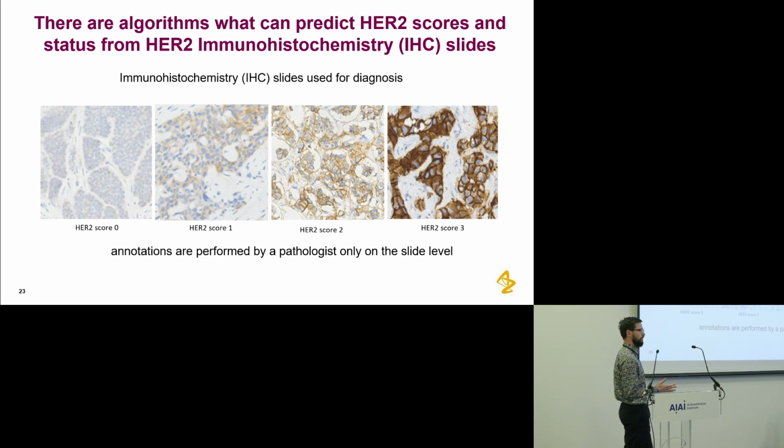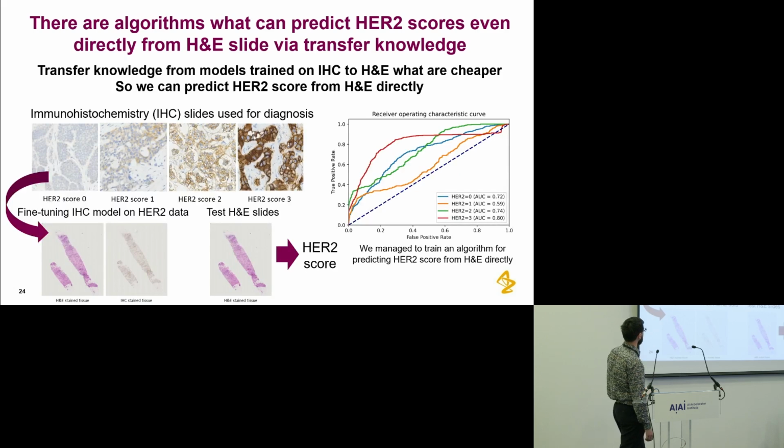Decisions are usually black or white: give this patient this type of medicine, or don't give. So you need to find this kind of cutoff, and then there is a way to grade from 0, 1, 2, 3, and pathologists do it. And then of course, we can potentially develop an algorithm, right?